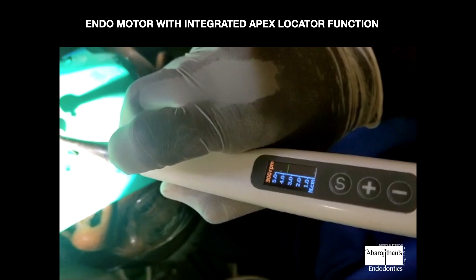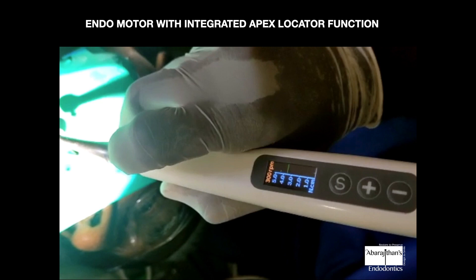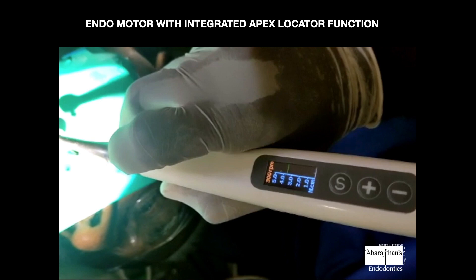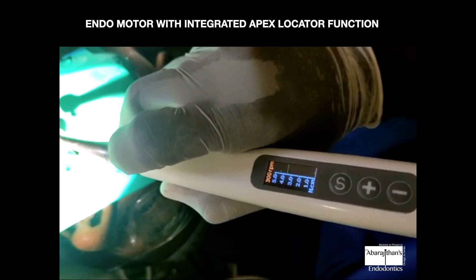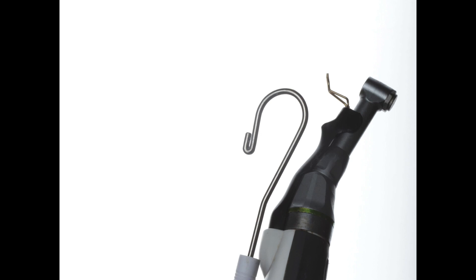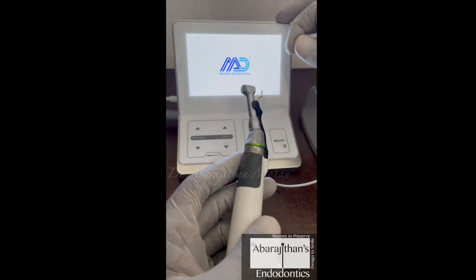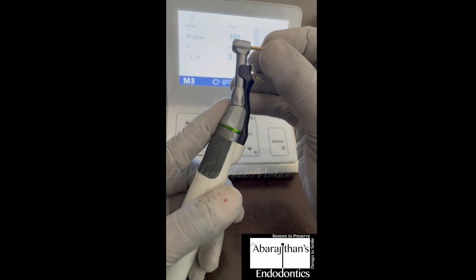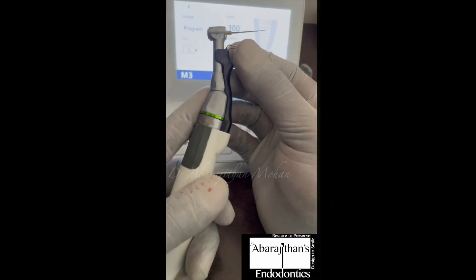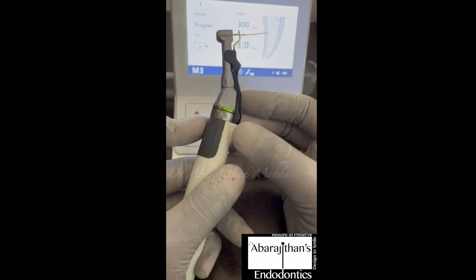Here you don't even need to note down your working length. Instead you just go on with the different file sequence, and all the files when working in the root canal — the endomotor is always integrated in real time with the apex locator. Some of these modern endomotors do not have any attachments to the head; the head of the handpiece itself acts as one of the electrodes. Whereas some other endomotors have a type of attachment to make the integration possible, newer endomotors have almost gotten rid of this extra attachment too.